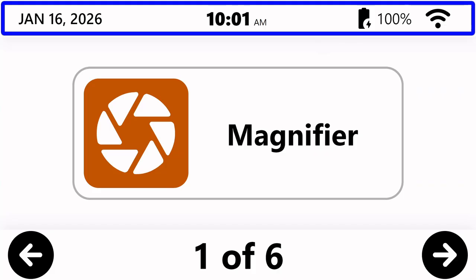Quick note before viewing this video. Throughout the video, you will see me moving between Prodigy's settings for Bluetooth and Prodigy's magnifier. This is done for illustrative purposes so that you can see what I'm doing with the Ray-Ban Meta glasses throughout the connection process. You do not need to bounce back and forth between these things in order to set up your Ray-Ban Meta glasses. It's just so that you understand what is happening.